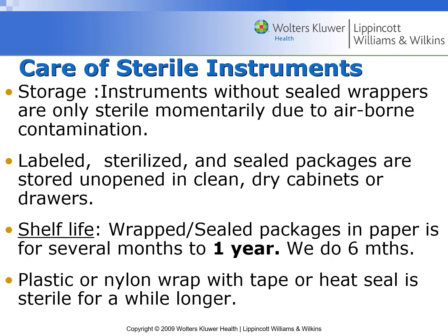So, care of your sterile instruments. You want to store them. When we store them, instruments without sealed wrappers are only sterile momentarily due to airborne contamination. This is another reason that we don't open any of these packages until we're right in front of the patient, because as soon as they are out there in the air, if the person next to you is using an aerosol, you can see how that would not be great.